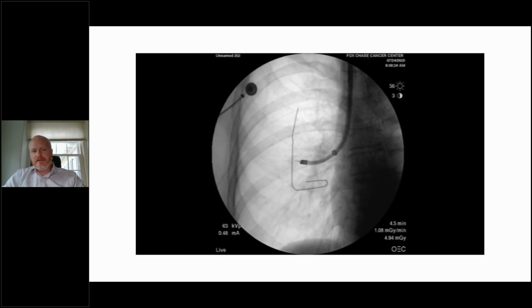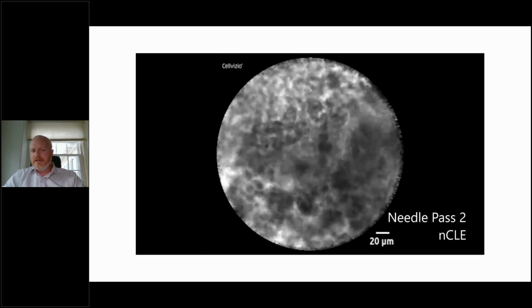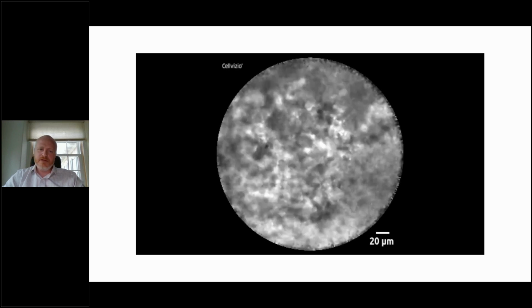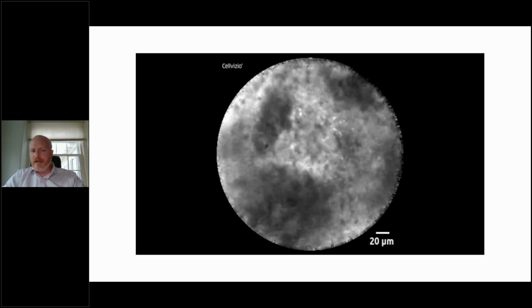I make a small adjustment just off center of the lesion and introduce my needle again. And you can see again, it's about where it was marked on radial ultrasound. But this time when I introduce my needle, you see much more consistent clumping of these pleomorphic cells. There's very good stability in the robot. I think previous users of confocal imaging were frustrated by any sort of shake or movement in the camera. You see there's some cardiac motion there.